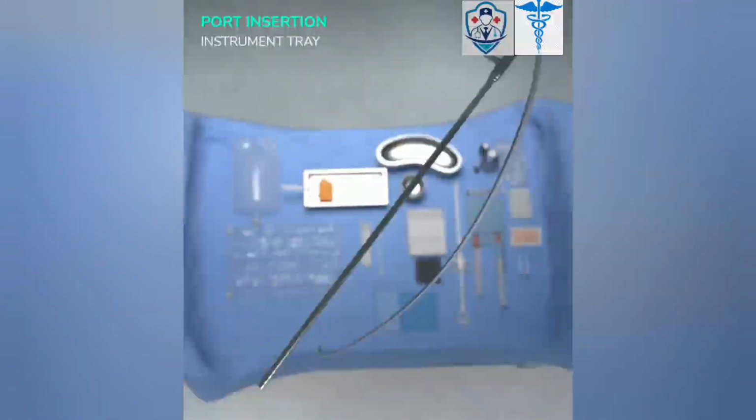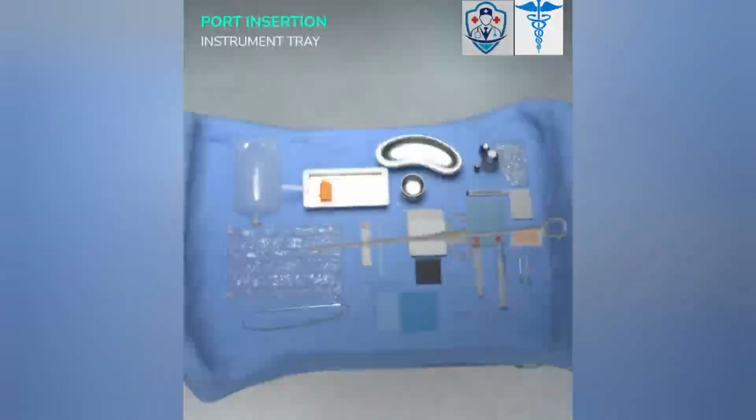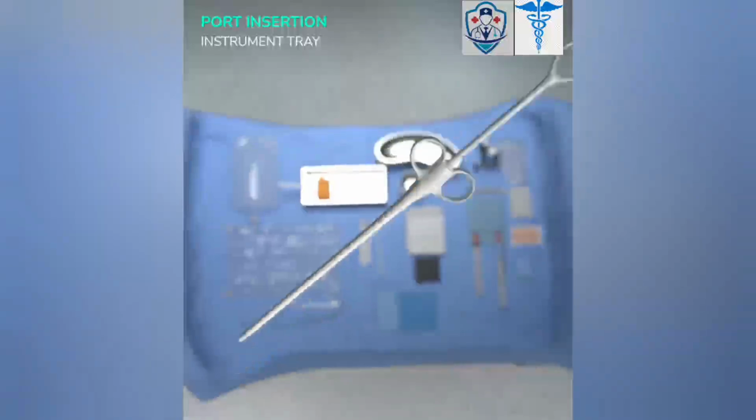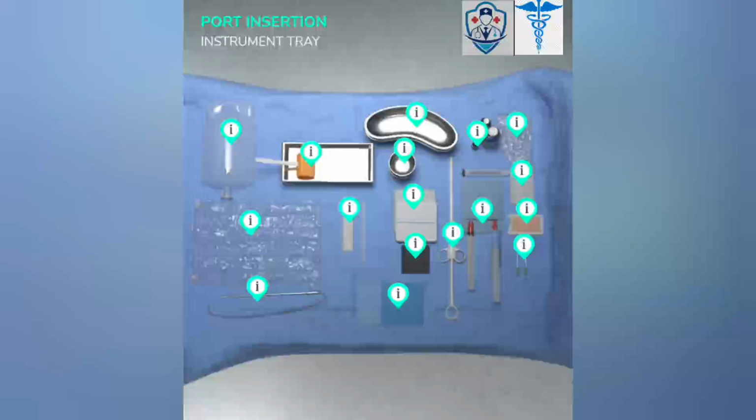The suction irrigation cannula is connected to a suction pump and an irrigation solution. This instrument can be used to perform a wash. The specimen bag is enclosed within the cannula of this instrument and can be released once inside the abdominal cavity. It is inserted in the Hassan port if a 5mm laparoscope must be ready for insertion into a 5mm port. After the appendix is amputated, it is placed in the bag and removed.